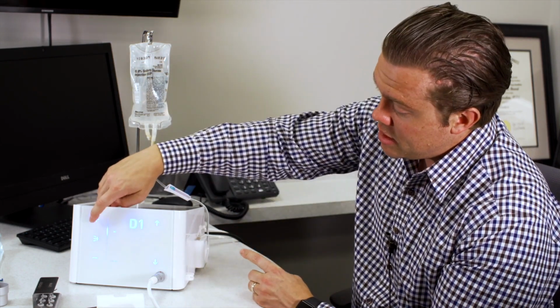So I like to keep mine 60 or 70% for all cutting applications.